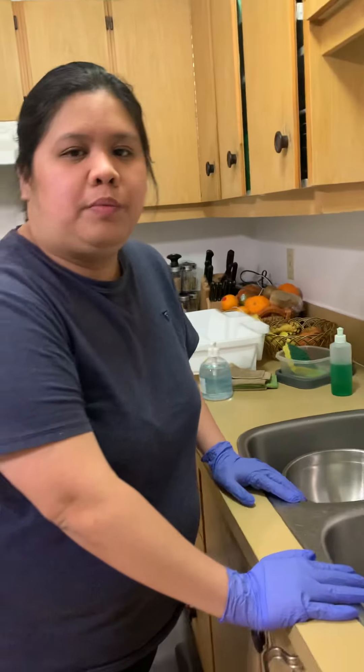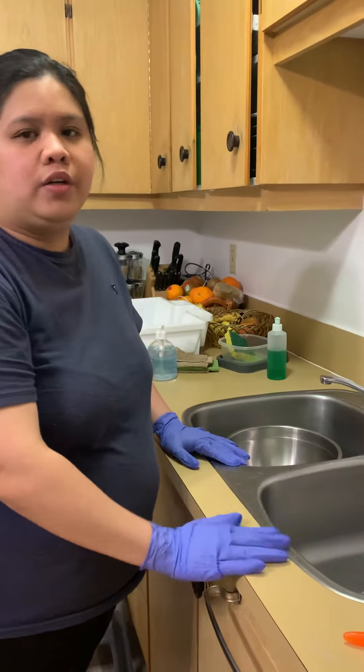In this video, I'm going to show you the proper way of cleaning the soiled instruments.